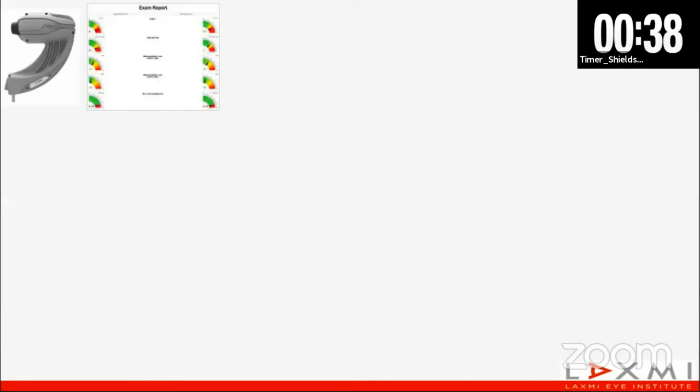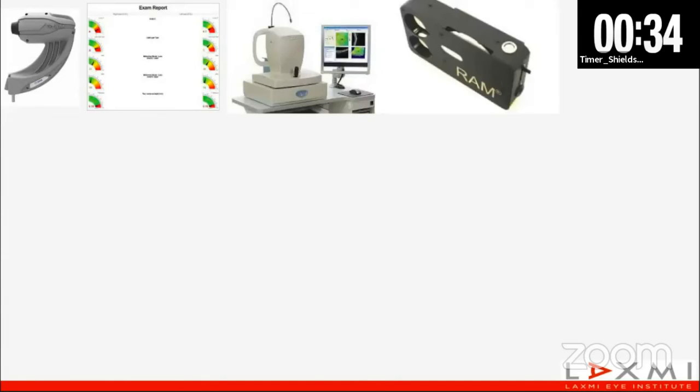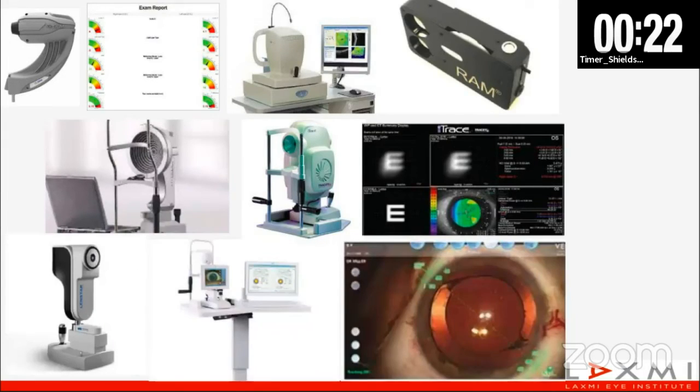Preoperative evaluation includes dry eye evaluation, macular evaluation including OCT, potential acuity meter, topography. This helps in ruling out unsuitable cases for presbyopic lenses. In addition, good optical biometry and image-guided system, especially in case of multifocal toric lenses, would help improve the results.